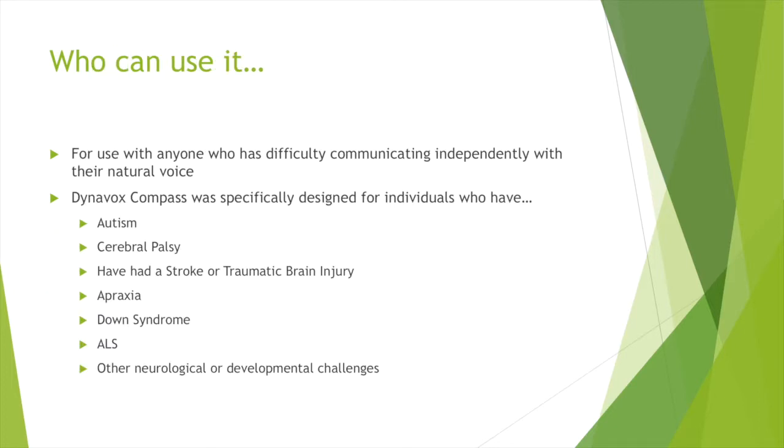Who can use it? The Compass application can be used with anybody who has difficulty communicating independently using their natural voice. Tobii Dynavox specifically designed this application for individuals who have autism, cerebral palsy, have had a stroke or traumatic brain injury, apraxia, Down syndrome, ALS, or other neurological and developmental challenges.